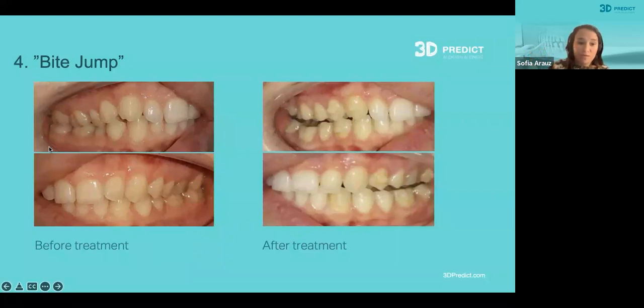At the beginning of treatment, the mandibular jaw was locked by the maxillary. So this was in a tight bite. When the doctor created expansion and distalization, he released the upper jaw, which allowed the facial muscles and the masseter to relax.